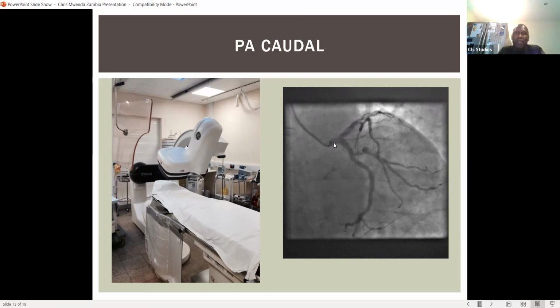That's the branch. One of the doctors will call it, that's the main highway. So basically, if the patient has got a narrowing here, we don't even touch that patient. The first thing we do when we are doing that case is put in a balloon pump. The balloon pump will support the heart. Then this patient will definitely go for surgery. We cannot intervene on that because if we look at the benefit against the risk, the risk is high.